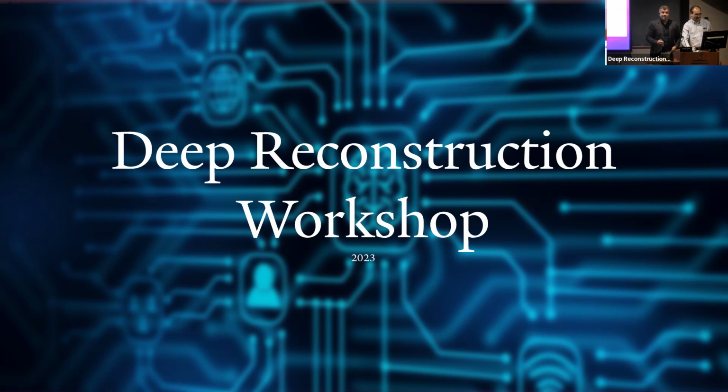Right. So the way that we're avoiding hallucinations is just to maintain the motion range of the input. So that's the only thing that we're making sure that the network will not do. The network can still have some issues, maybe with blurring between motion states, but it's not going to hallucinate by creating a new motion state which is outside the motion range of the input.